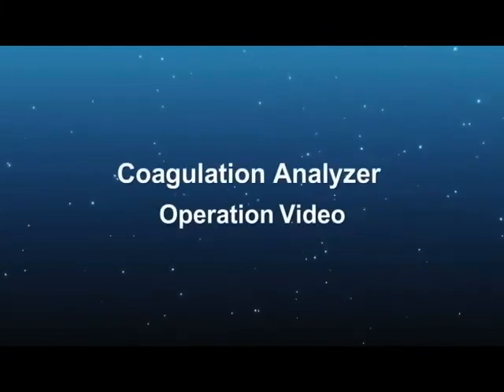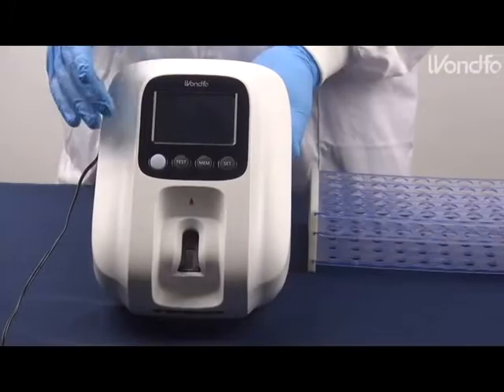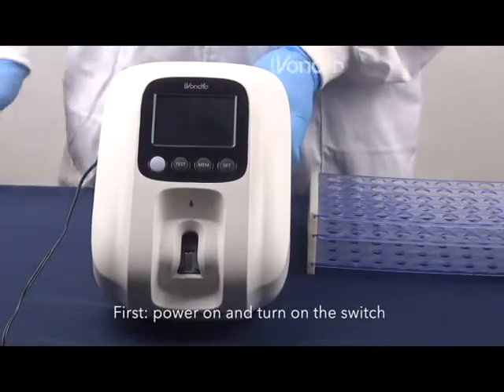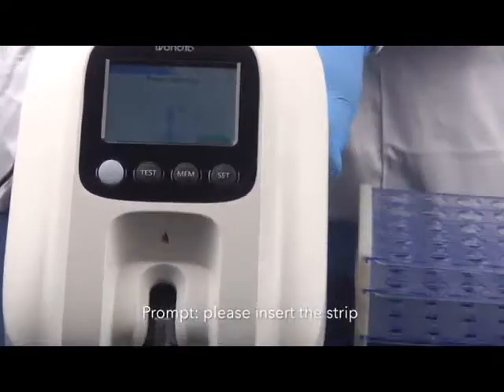Welcome to Wondfo's Coagulation Analyzer Operation video. First, power on and turn on the switch. Please insert the strip.